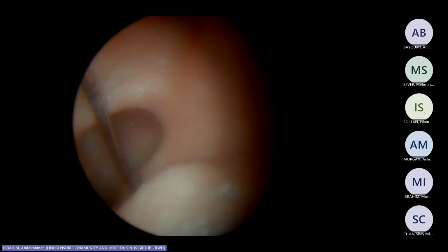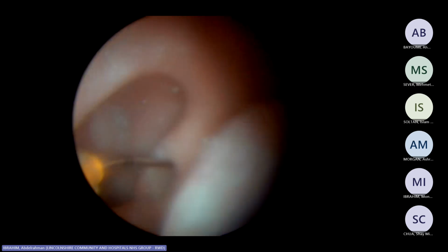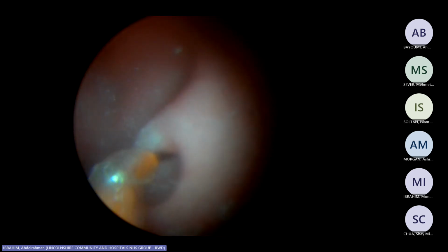Okay, and then I feel, you see the edge here? You see the top edge here? I feel it, push, and then go inside. Of course, this is not as natural. And then after you go through, you start pushing it in.